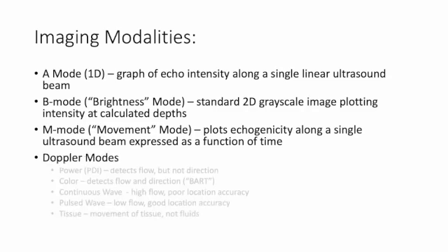Lastly, we have our different Doppler modes. And while there's a whole bunch of different types of these, we'll go over the two that I want you to know in detail, power and color, at a later slide.